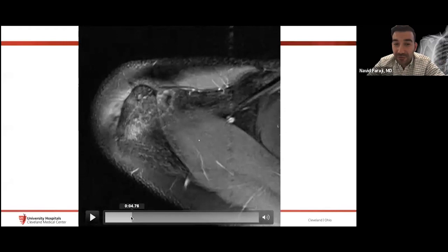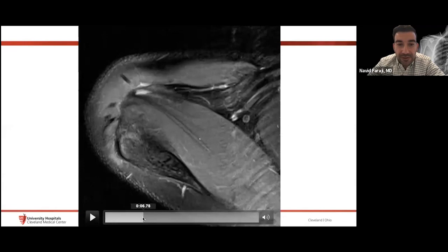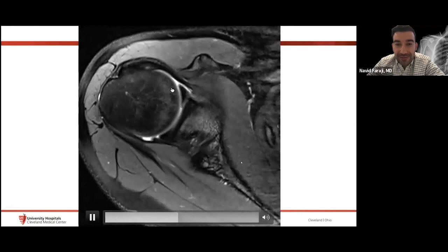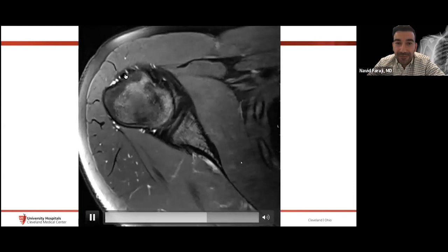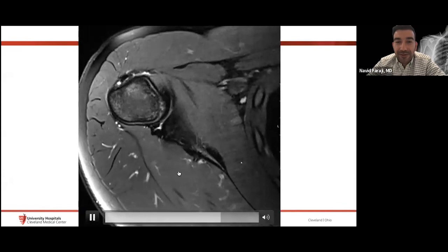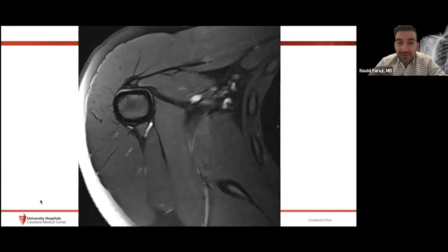On the axial fluid-sensitive fat-saturated sequence, we can assess the AC joint and check for an os acromiale. The supraspinatus tendon courses over the humeral head. Predominantly on axial imaging I look at the labrum — the anterior and posterior labrum are well visualized axially, while the superior and inferior labrum are best seen on coronal. These planes are used in combination to characterize both labral tears and rotator cuff tears.